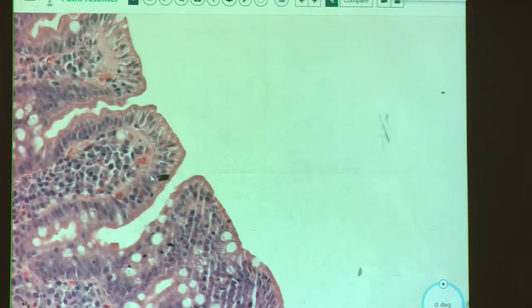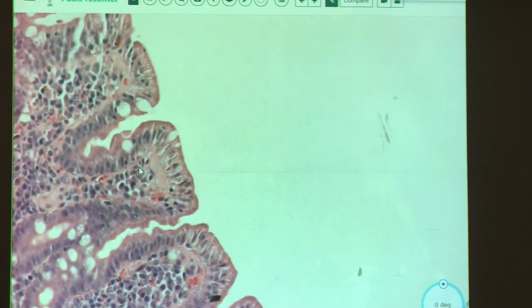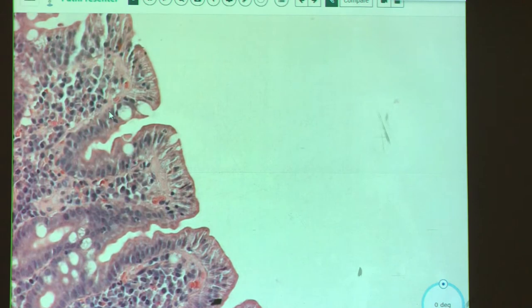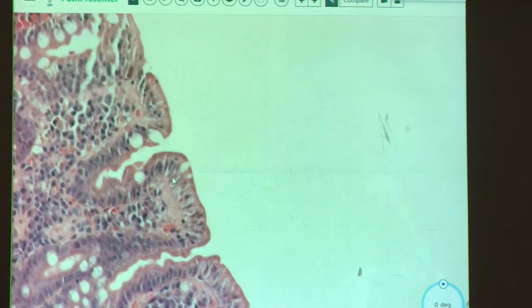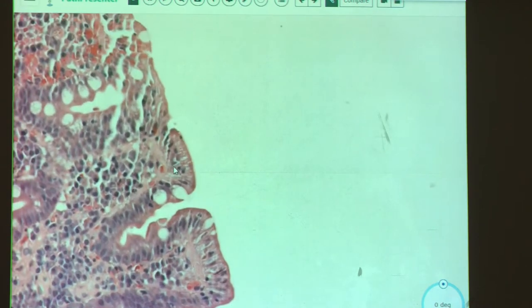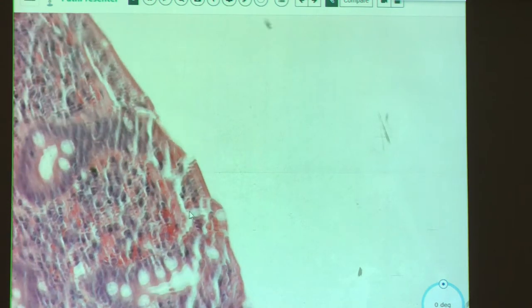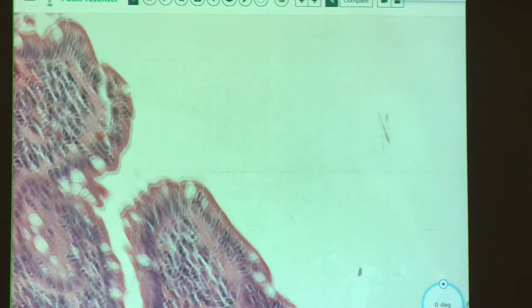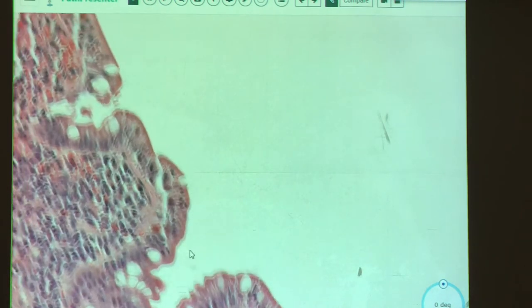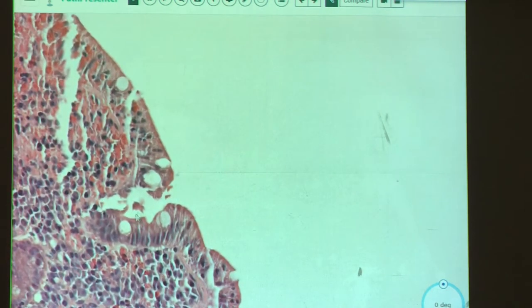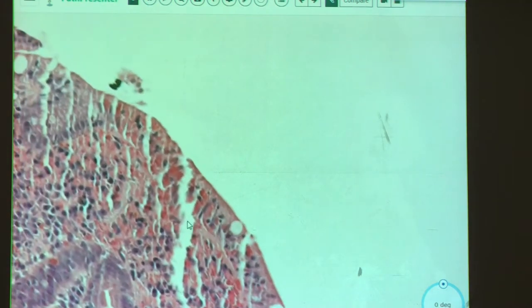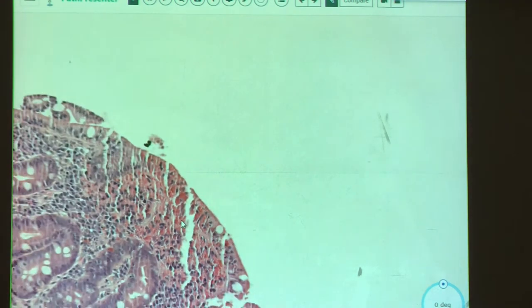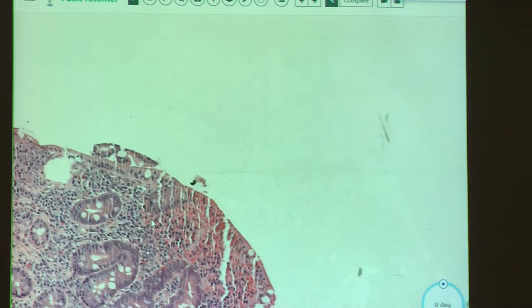Looking at the individual epithelial cells, there are some lymphocytes inside the epithelium. You should have very high suspicion for celiac disease here. Look at the history — it should tell you a little more. I would say celiac disease without any other hesitation.